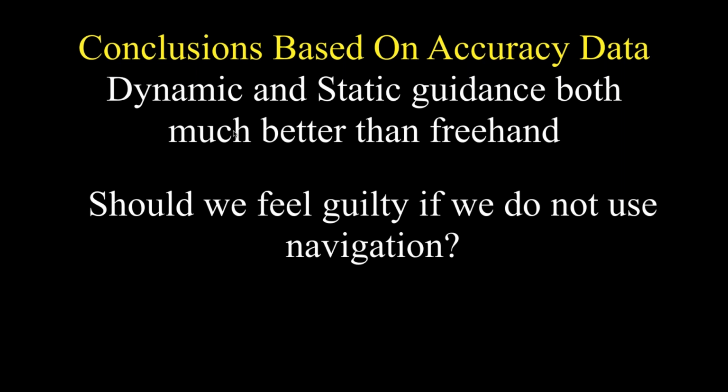And now, if you don't use a cone beam doing implants, you're not following not a standard, but a very strong encouragement of using that machine. I think navigation is going to be the same thing because you can do it better. So I think this is something you're going to have to think about because the technology actually works. It works every time.